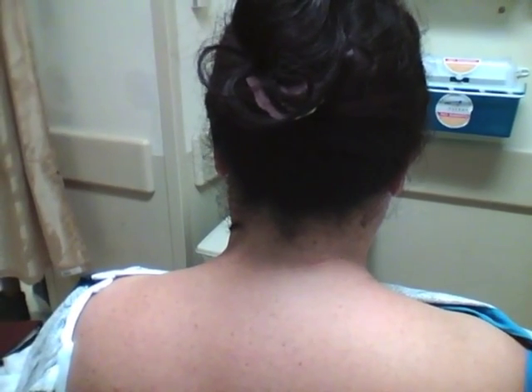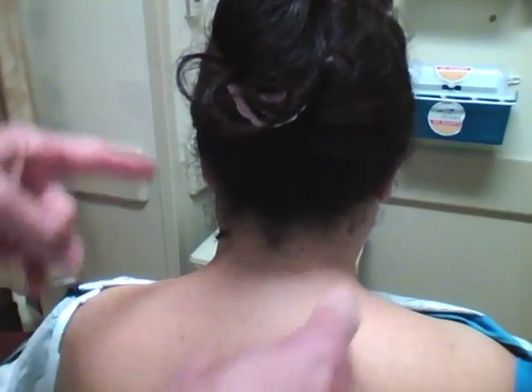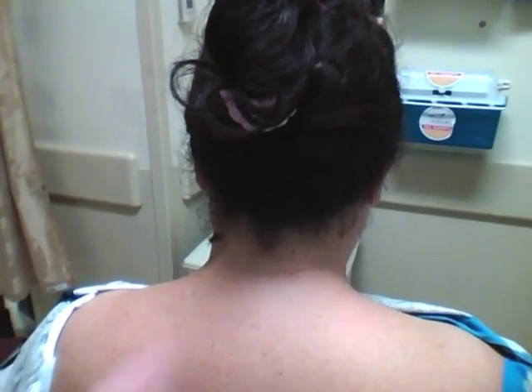What we're going to do is a lower cervical paraspinous block on this young lady. She's got a migraine headache and she's had it for a couple of days now and it's really not getting any better. The way this block works is it interrupts the circus motion of some of the re-entry type pain fibers that run from the back of the head down through the neck and up again.